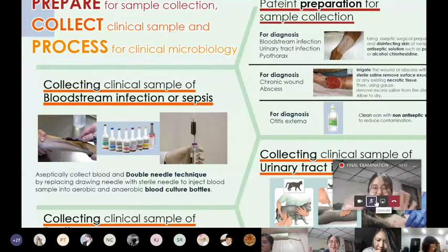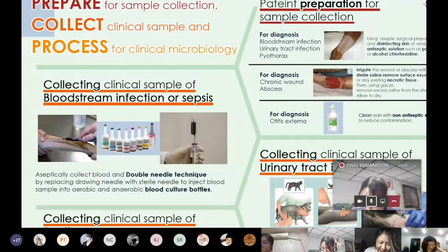Just wanna know. Yes. Okay, so I searched for your question. In the literature, they have a clot, they call clot culture. It's a modification of a blood culture. In the clot culture, the blood is allowed to clot, because the advantage of clot culture is that serum can also be collected and investigated for serological tests.